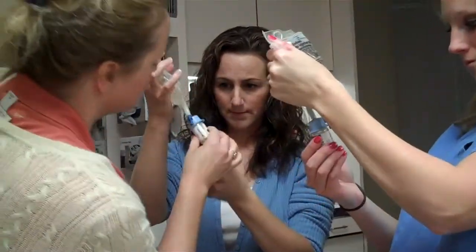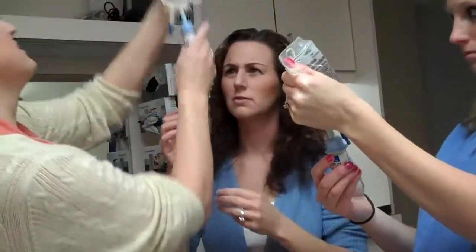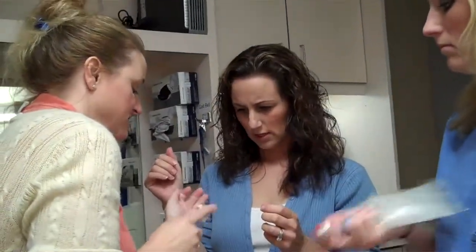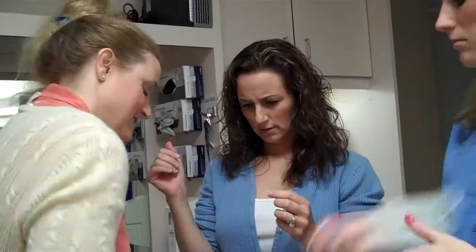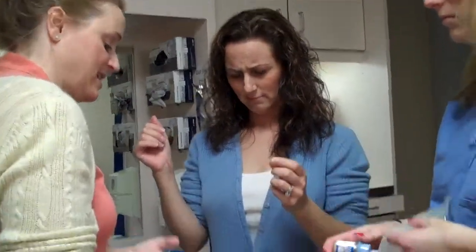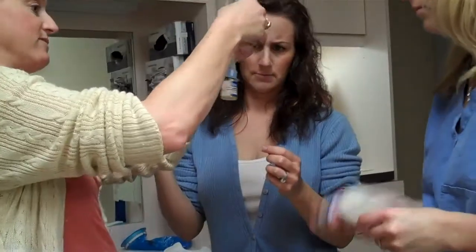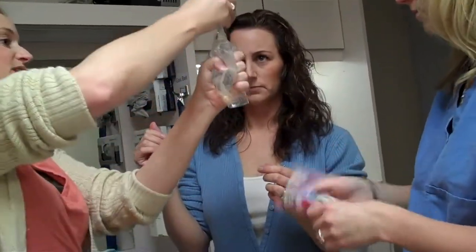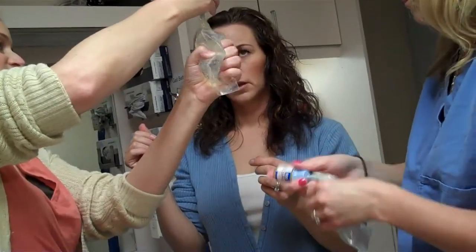And so when you get liquid in there, is there any liquid in there? I don't know, it's hard to tell. Oh, yeah, there is. So now you just start dissolving it, shaking. And this is what I do. I keep going back and forth. I push some fluid in there, and then I pull it out. Upside down, you start pulling it out. Can you see how that works?